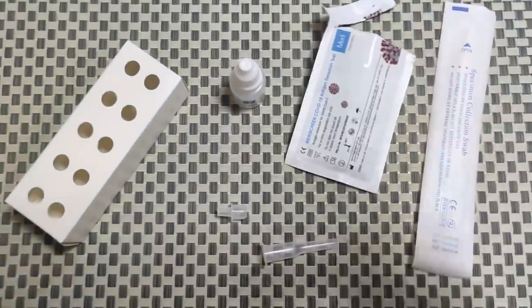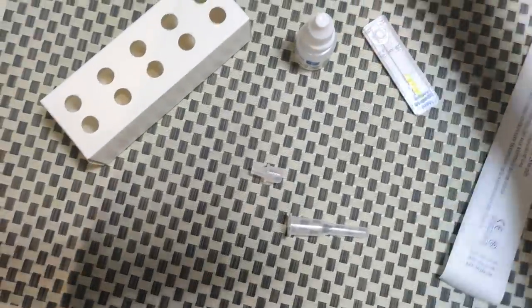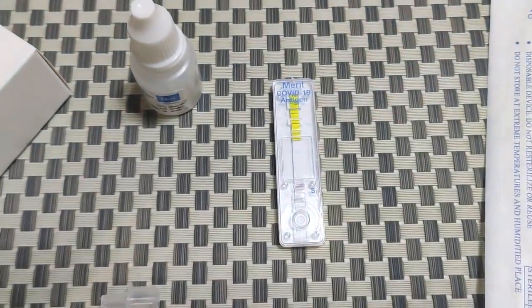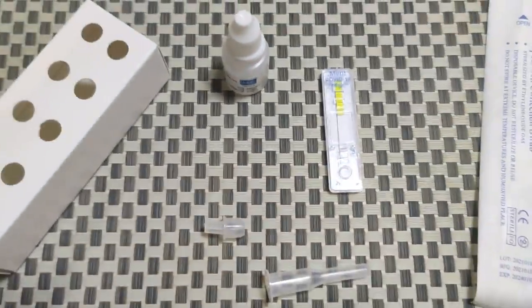I have opened up the kit. Let me take it out. This is what we need — this is the test kit. You can clearly see this is the kit. This is where you need to put the drop after you mix it with the sample.